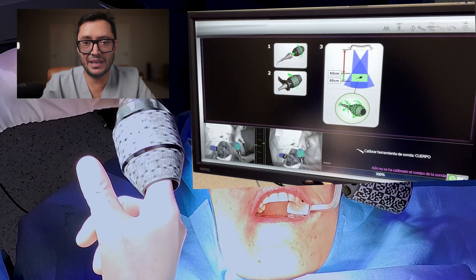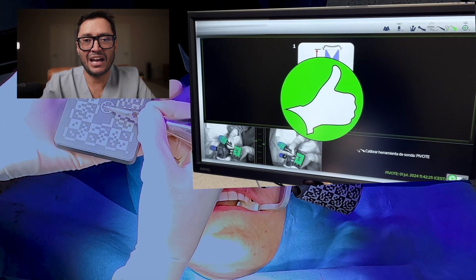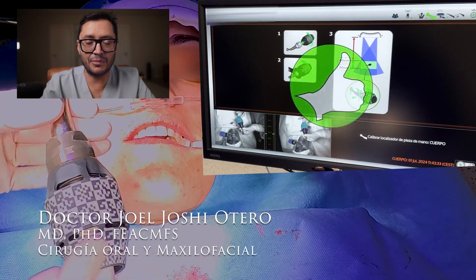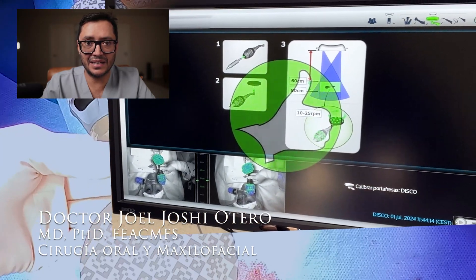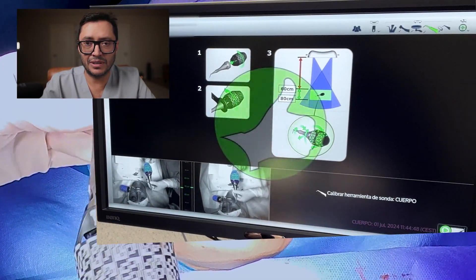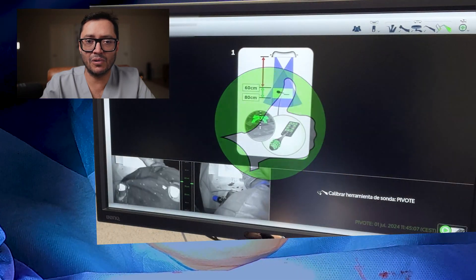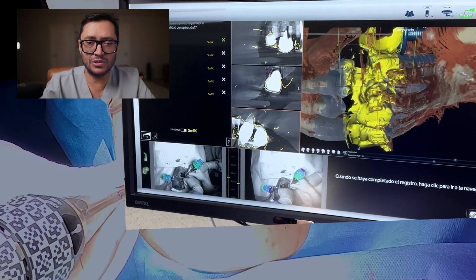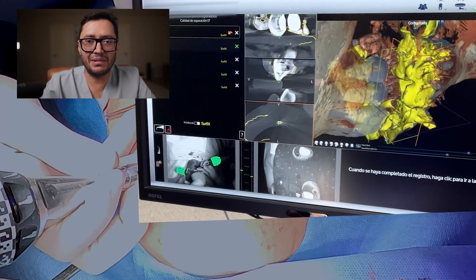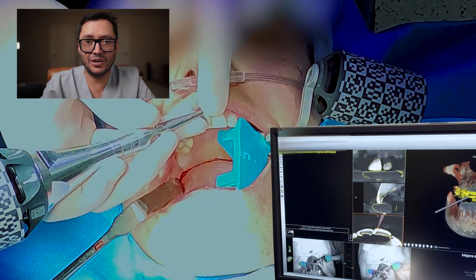If the patient is edentulous, then we will have to fix the tracker into the maxilla or the mandible with screws. Now, this is the part where you have to synchronize all the instruments that you are going to use with the stereotaxic cameras that we have on the X-Guide. This process is well known by our nurse, so she goes fairly fast doing the calibration. Every time you achieve the calibration goal, you will get a note reminding you that everything is going okay — you just follow the steps. This may take maybe three or four minutes, not more. Then we improve the calibration and check that everything is going according to plan.